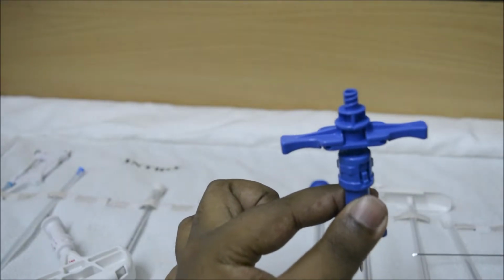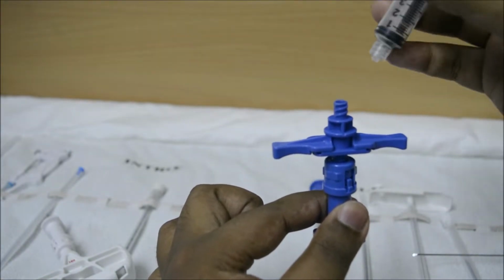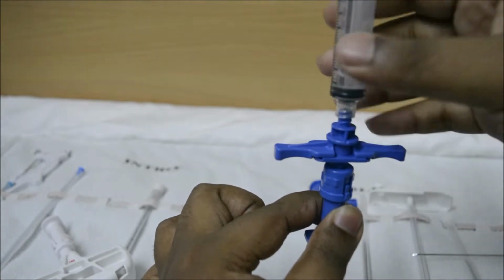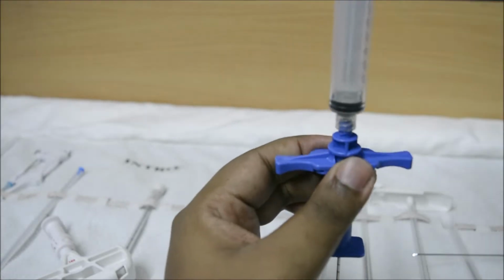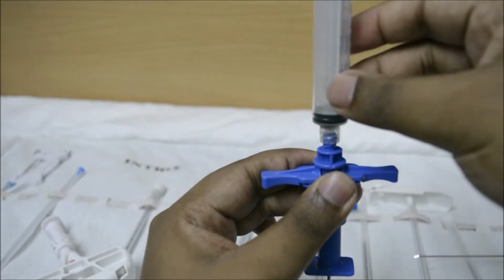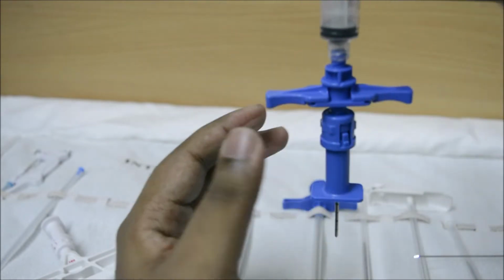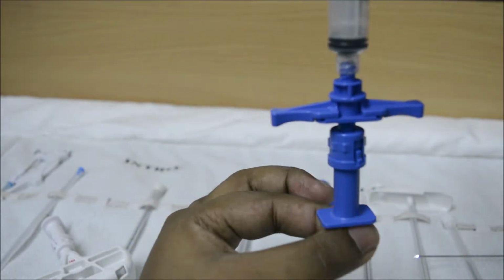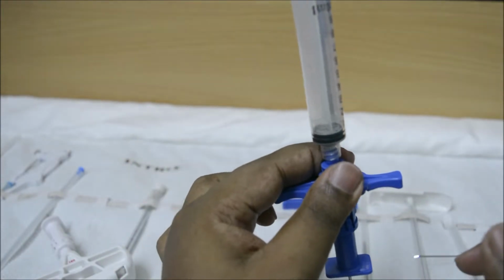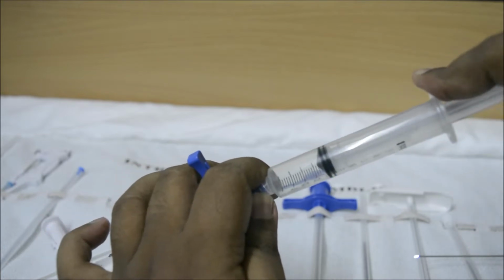Now a special form of syringe called the Luer lock syringe is brought in proximity to the needle and then it is placed on the needle top, and now you can see it is completely locked and there is no point where air can come in. So it's completely a vacuum system. Now the needle is inside the patient's body and the upper part of the needle is connected to the Luer lock syringe. Now what the doctor does, he or she simply aspirates.